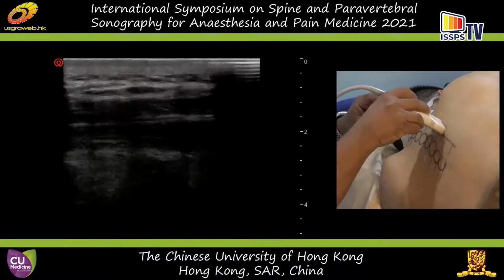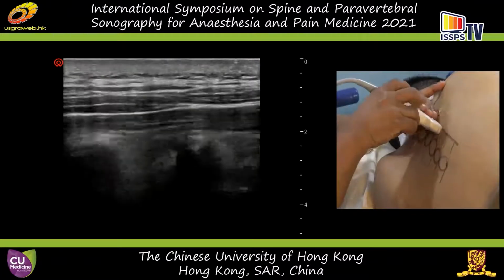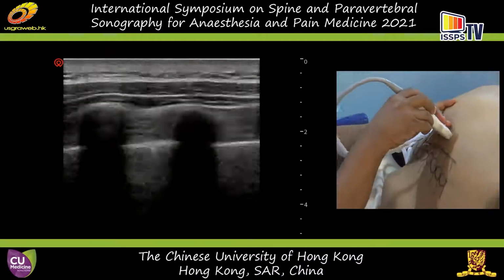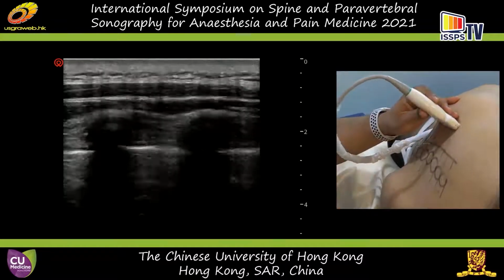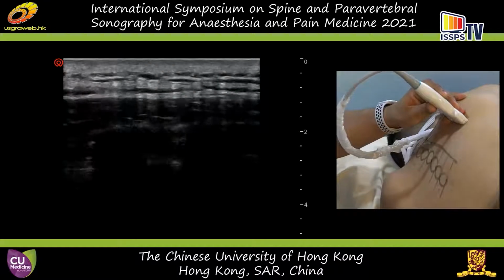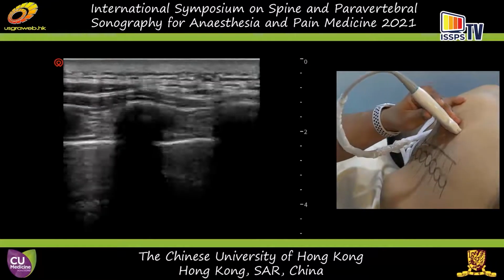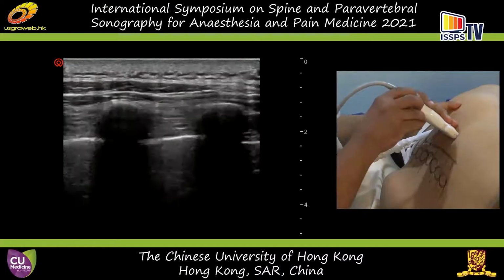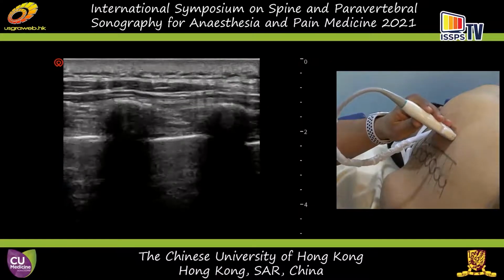Second is, I'm going to perform the scan somewhere in the mid-thoracic region, okay? And you can see here the transitional anatomy I will show you as we come from a lateral to medial direction. You can see the ribs are more lateral. You can see here, we are scanning at a lateral, just below, somewhere near the scapula. You can see they are very rounded. You can see the pleura is very clear. It's very sharp. In fact, the intercostal muscles are very clearly defined.